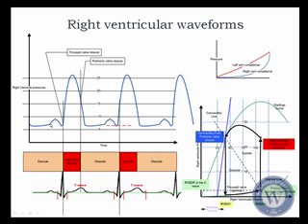It's a pressure indication to you of how healthy the atrium is. If the atrium is in atrial fibrillation, the A wave in here will disappear. So it's another way of picking up that you're in atrial fib or atrial flutter, is that you'll see a loss of this A wave kick. As a consequence, you lose that ability to help fill the right ventricle adequately.